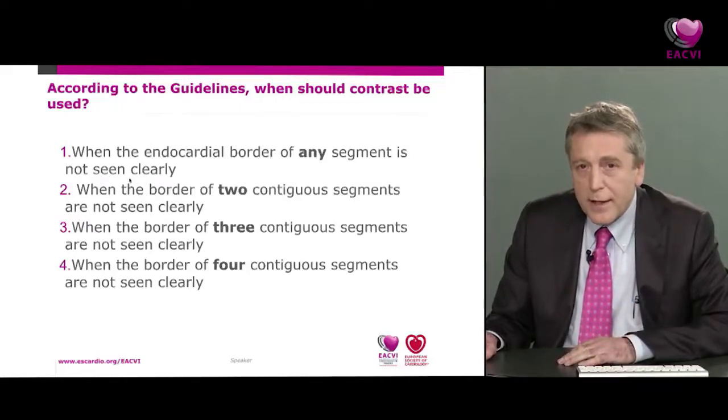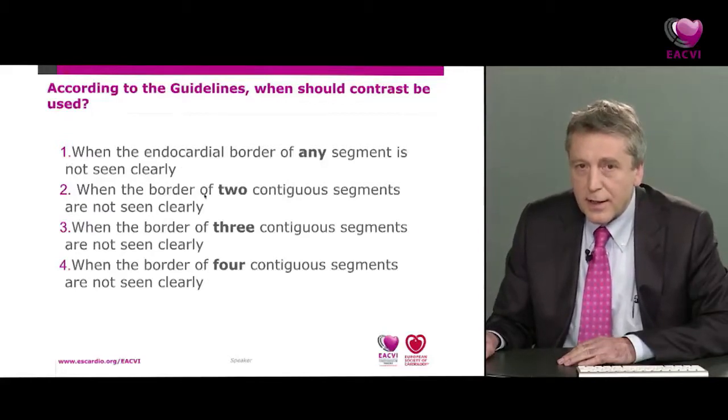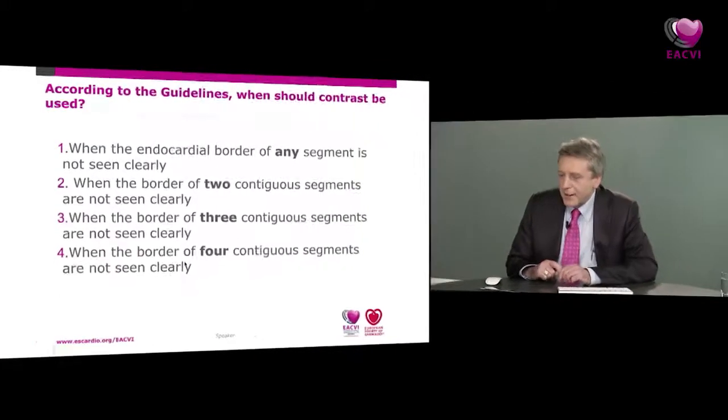Should it be when the endocardial border of any segment is not seen clearly, when the border of at least 2 contiguous segments are not seen clearly, or vote 3, when the border of at least 3 contiguous segments are not seen clearly, or vote 4, when the border of at least 4 contiguous segments are not seen clearly? So Roxy, they have some time to do that. How long have they got? Yes, so they've got 1 minute to do this.